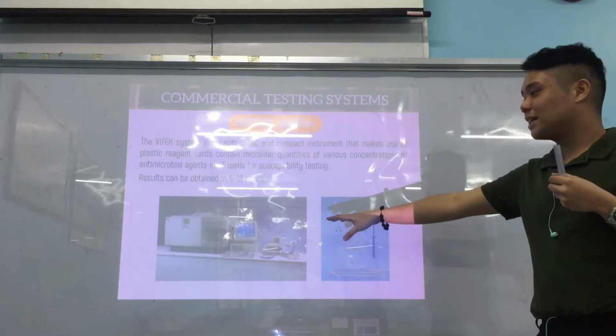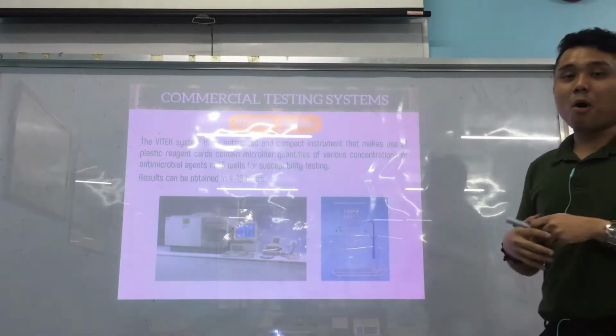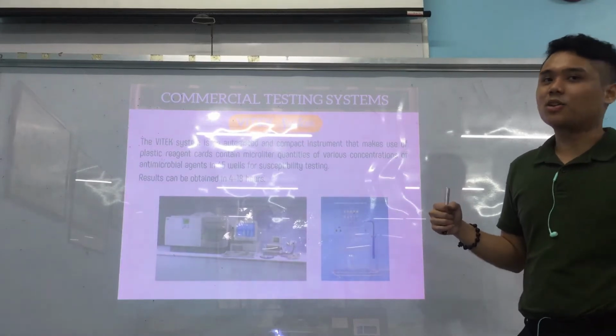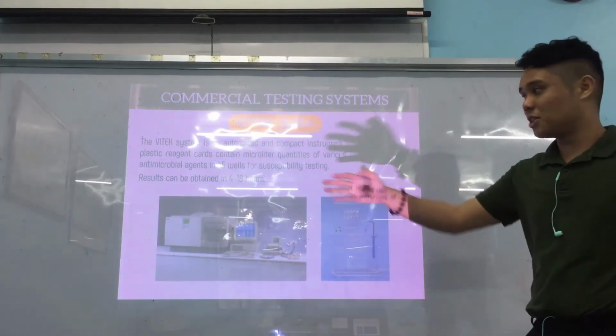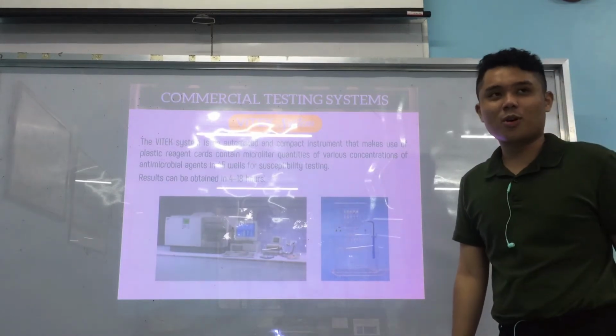But it's actually just the Vitek. It's the wells that make that sound when it finishes, like a sound of something attacking metal inside of the machine. So that's Vitek. You'll get to experience that in your internship, hopefully.